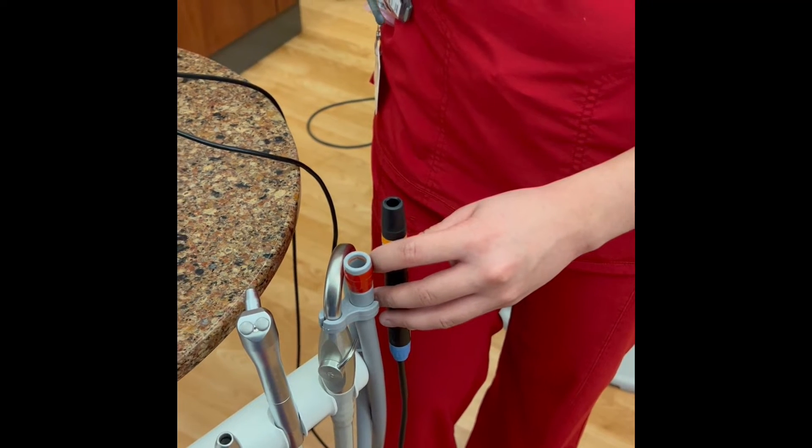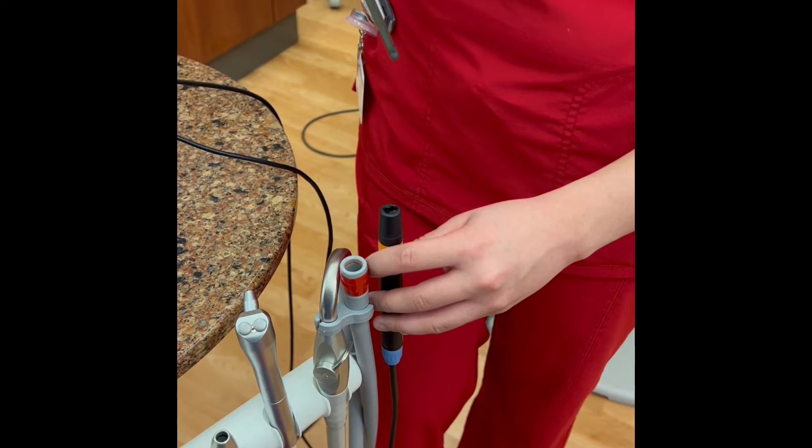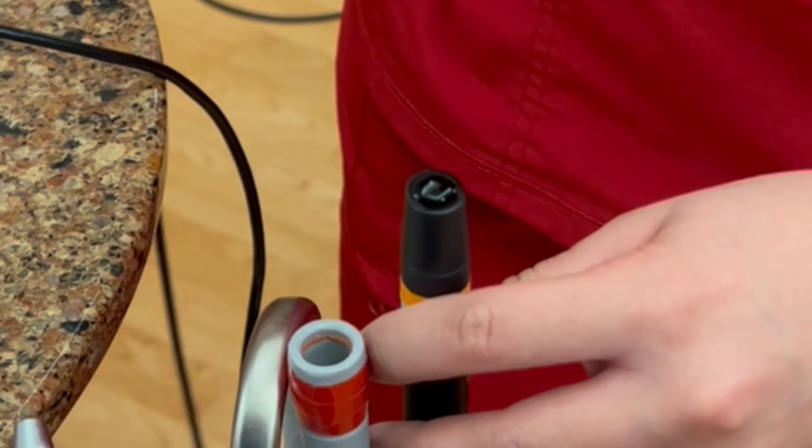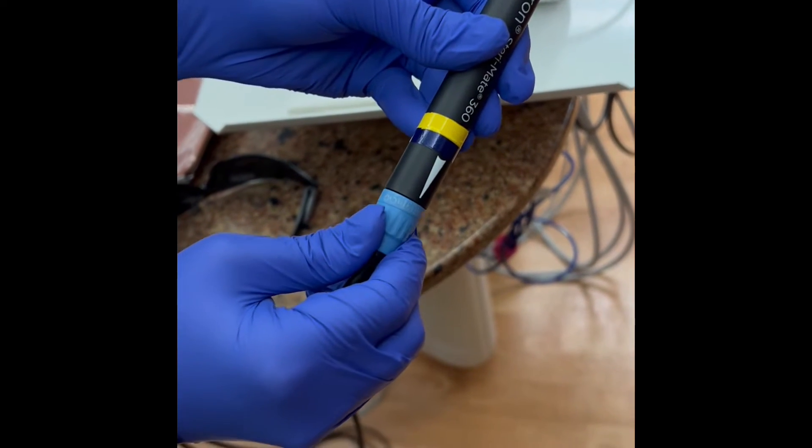After purging is complete, hold the SteriMate upright and press on the foot pedal to activate the water. Keep pressing until a water bubble appears. You can use the blue dial on the cord to adjust water flow as needed.